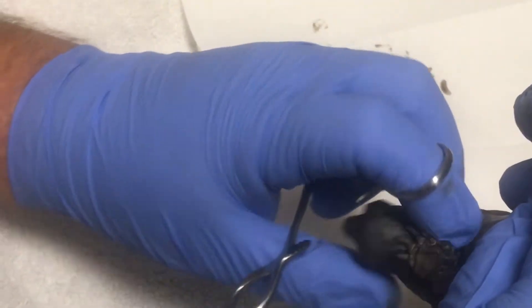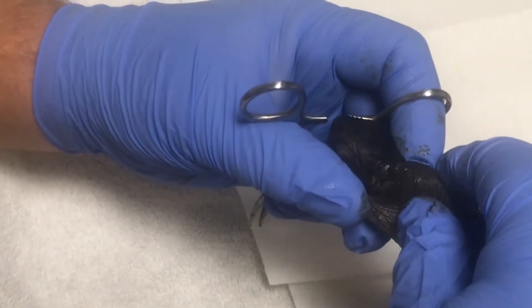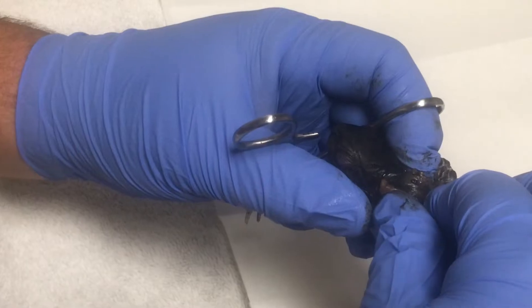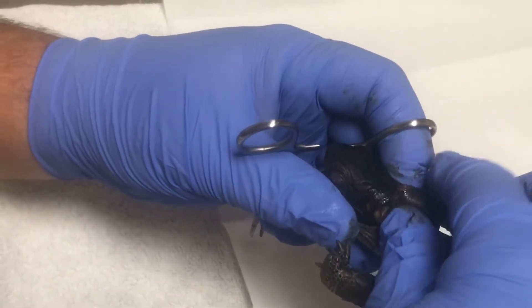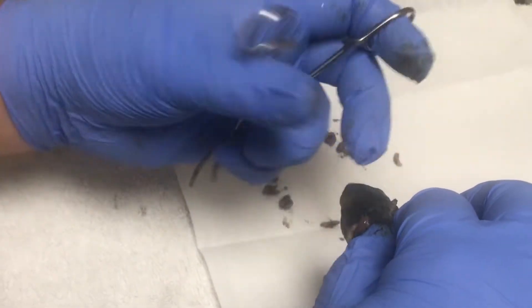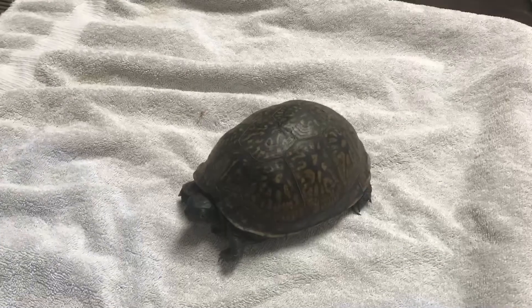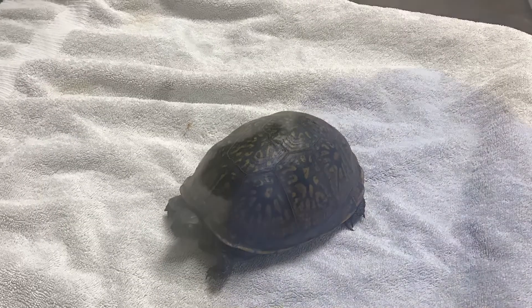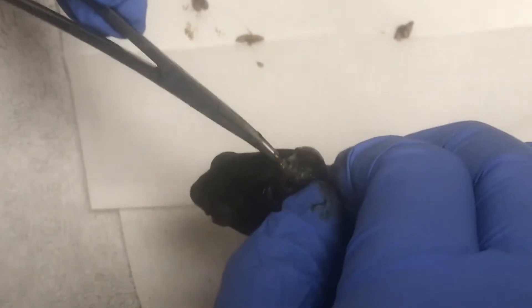I'm working here. I know that feels weird, but we've got to get these things out of your head. Oh, there's one popping out right there — look at that little zit. I did say mildly sedated, right? She missed filming two more because the phone keeps ringing. You know, sorry.